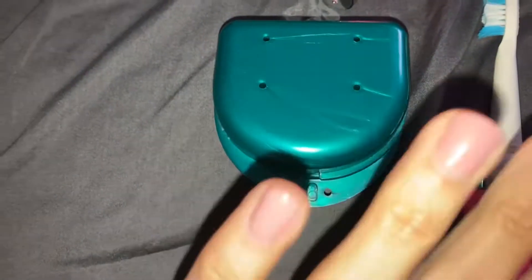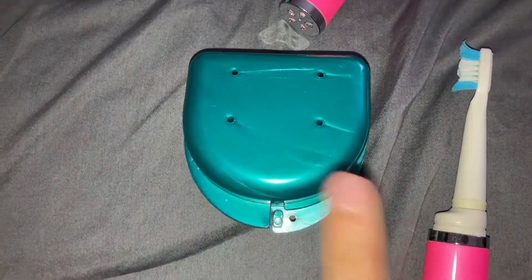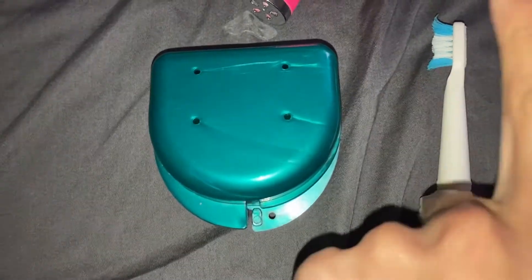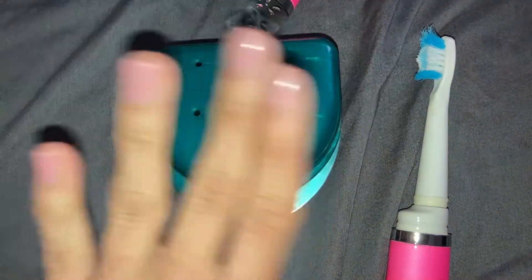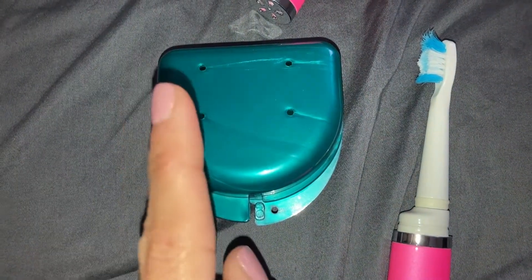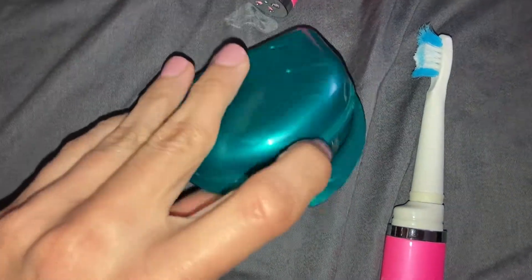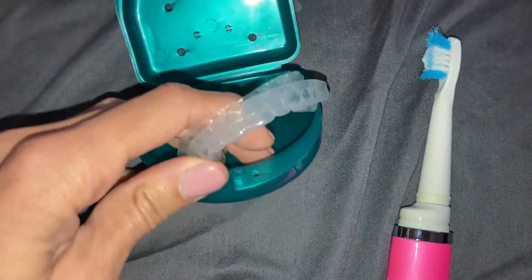So the first option — and you could choose any of these options, it does not have to be this one, and they're all good options. The first one would be a toothbrush, antibacterial hand soap, and water. Do not use anything hot — it will disfigure your retainers. You can use warm or cold water; I suggest warm water.